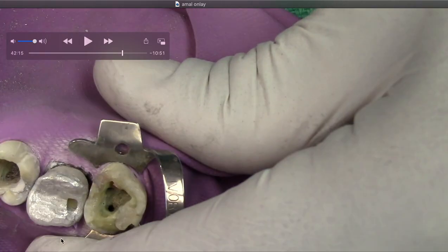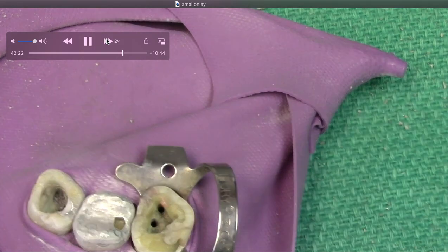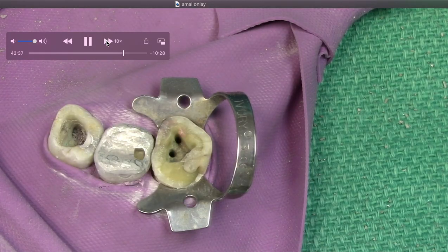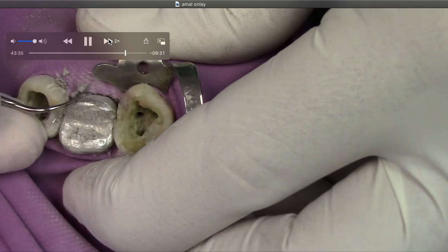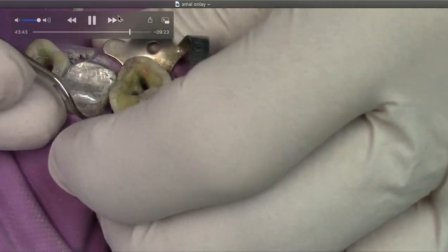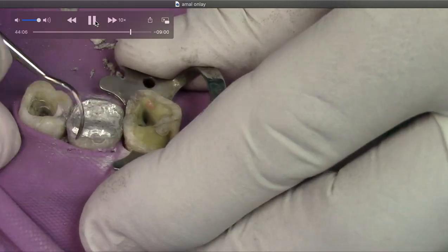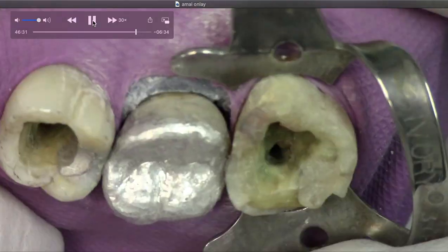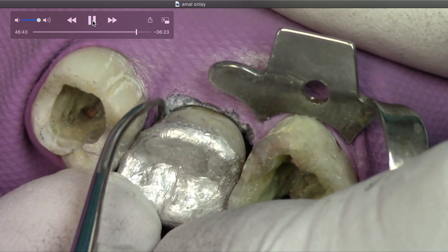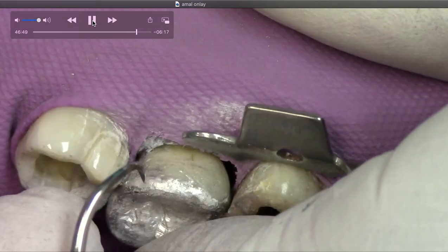We're going to make a prep — you can see I had to go this far around just to get a full two-millimeter thickness back. That's a simple fix: place some amalgam in there, spread right past it, burnish it down. This restoration is essentially done — time to check it. I'm just doing this last bit to have some credibility and make it look decent. One of our captains says he tells the patient 'I'm going to bring you back to polish it — it's for me, not for you.' When I was in Belgium I had time to bring patients back and polish amalgams, but honestly they couldn't tell the difference.